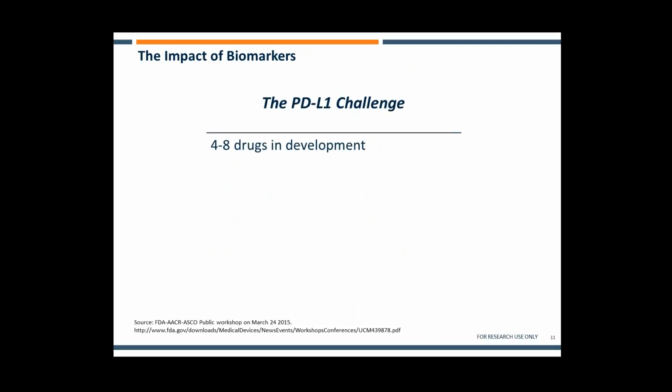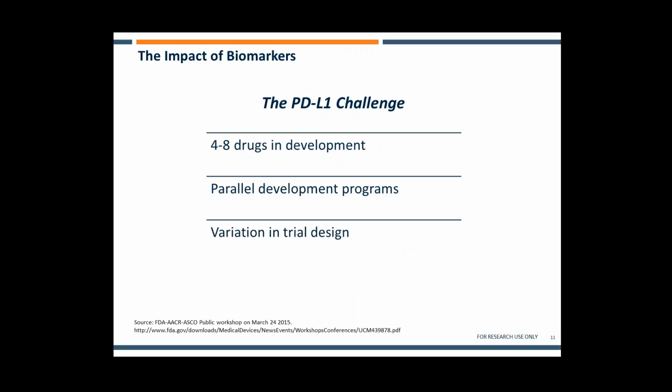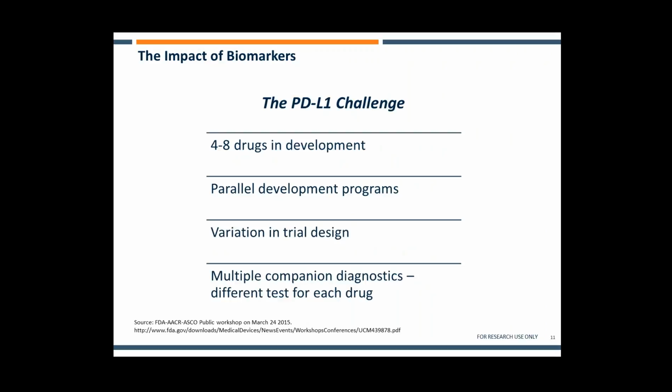So the PD-L1 challenge, just to put it into a few summary words here: there are 4 to 8 drugs in development, each with their own parallel development programs, each with variation in clinical trial design. And in addition to all of this, there are multiple companion diagnostics. There is a different test for each drug.